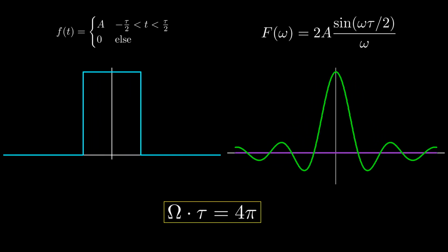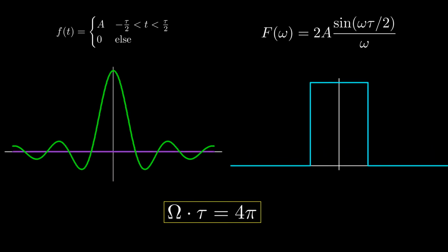On our last video, we asked the question, how far off of Larmor resonance can your excitation pulse be before you're no longer exciting spins? This is the answer to that question. It depends on the duration of the pulse and thus its frequency content. Note that this relationship works both ways. If you deliver a Sinc pulse to spins, you will excite a square-shaped band of frequencies. More on that on our next adventure.